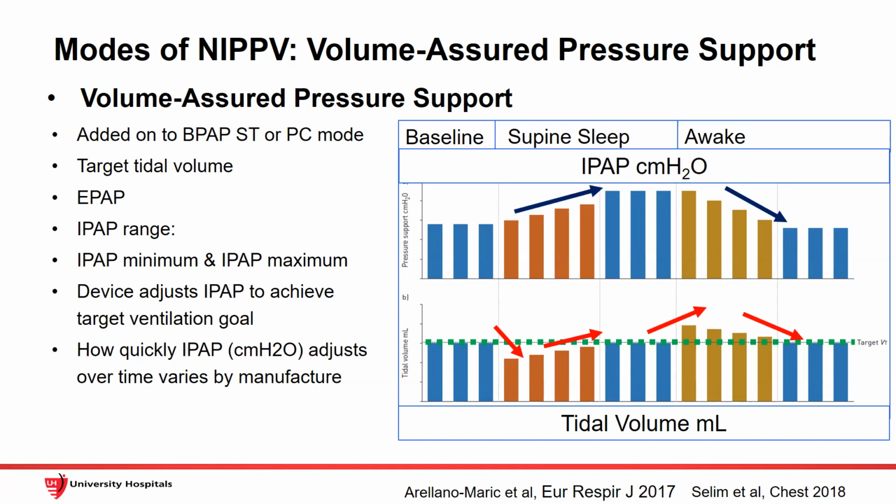ResMed, I think, gives you a lot more degrees of freedom, unless you know something about the new EVO Trilogies. I haven't had a chance to play with those yet. No, me neither. But I will say, just for the fellows, you have to know what's up and what's down. Sometimes it's a percentage or a number, so always know what the units are and what it means.